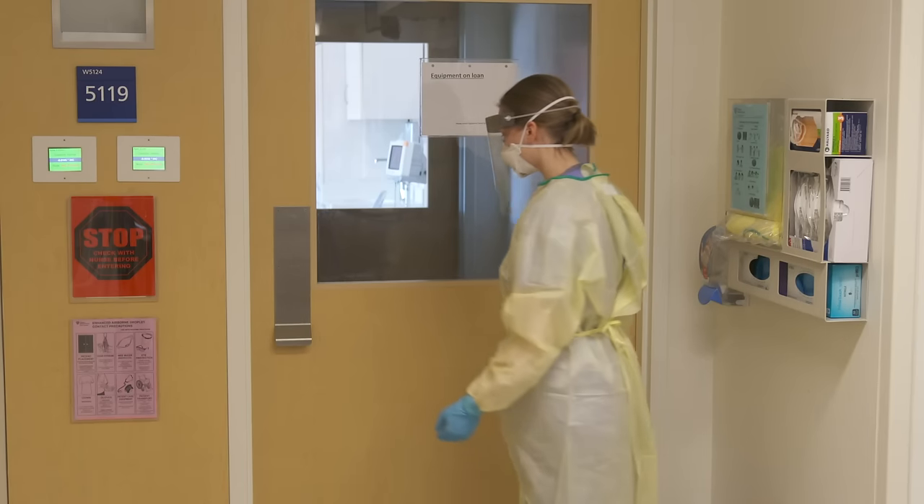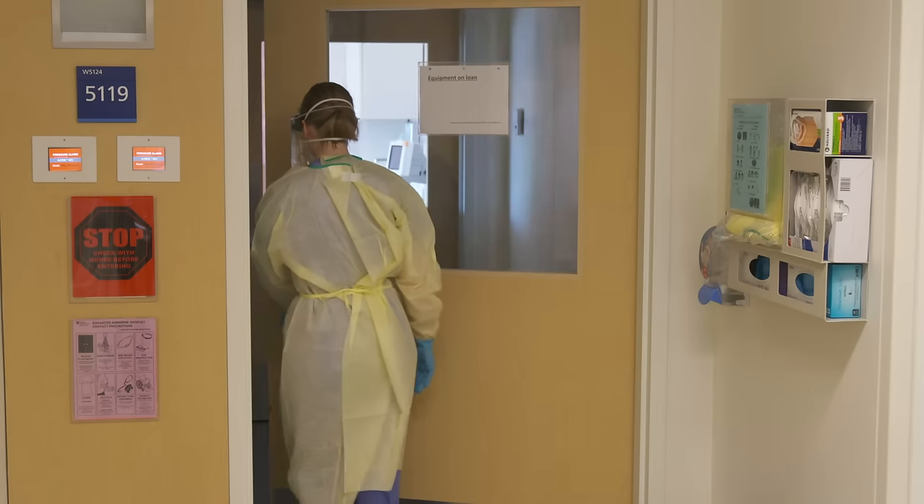When entering a negative pressure room, ensure each door is securely closed behind you.